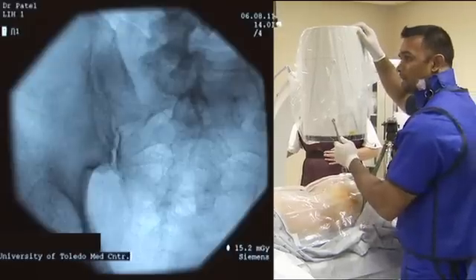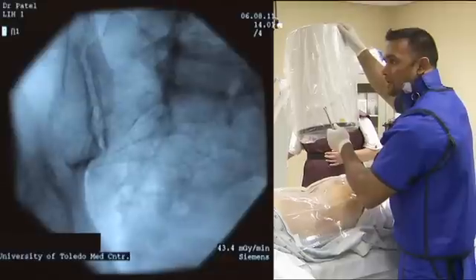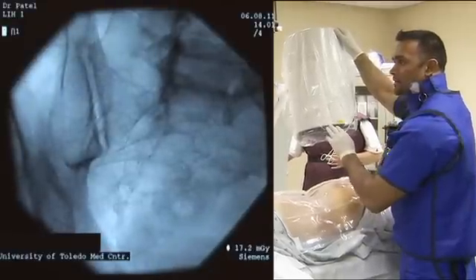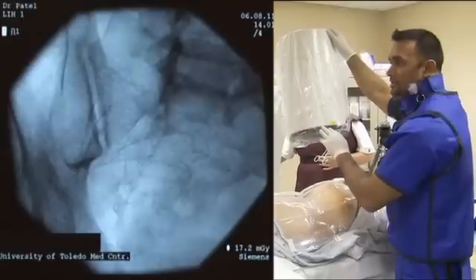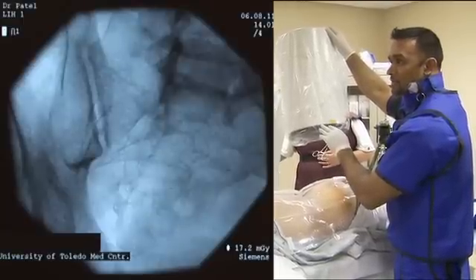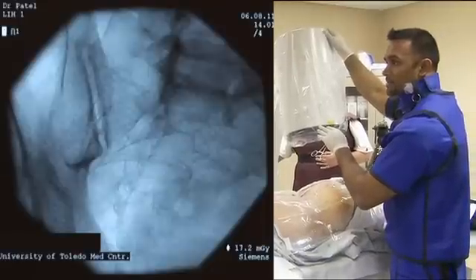When we do the SI joint injection, we typically want to start off by getting a true lateral image which looks like this. This is where the anterior and posterior SI joints are superimposed, which is what we see in this particular picture.